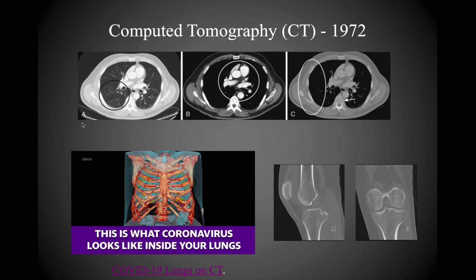All right, so now why CT? What are the advantages of CT over X-ray? Some of them include significantly enhanced resolution. If you look at these images across here, you can hopefully already appreciate that the resolution is far, far better than what you get on an X-ray. You also get multiple views of the body from one scan.